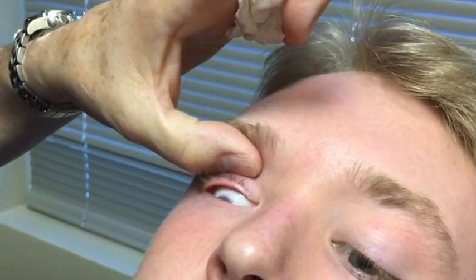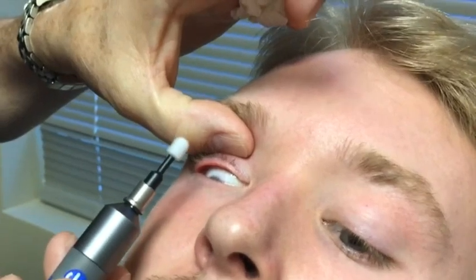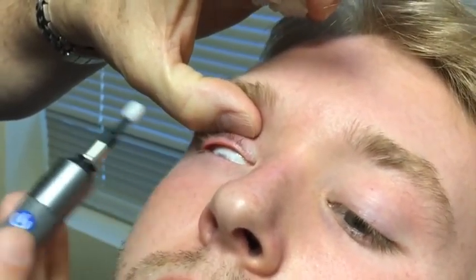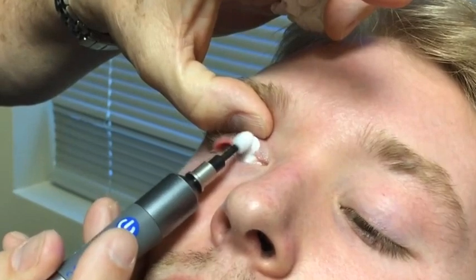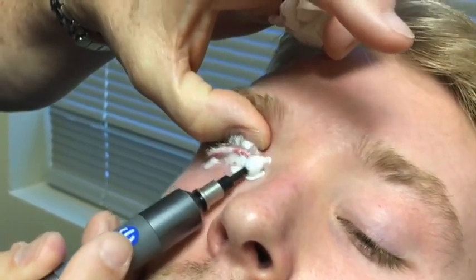The patient will feel a little bit of pressure during that time. Same hand position here. Flush to the face, parallel to the nose. It's just a fingertip movement. I'm not using my hand to move. I'm not using my arm. It's just fingertip moving. And we get right in there on the lid margin and scrub the entire lid margin once again.